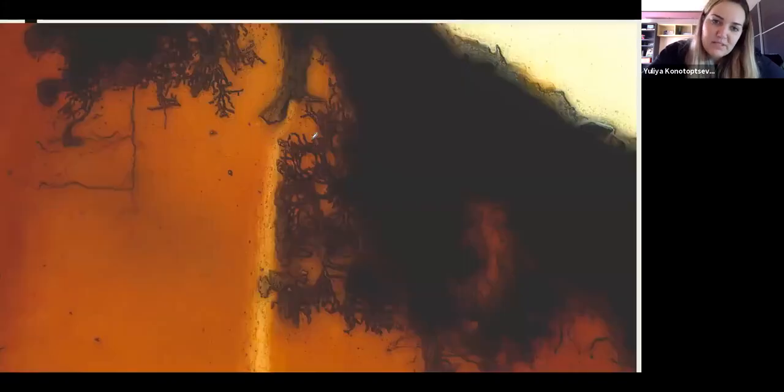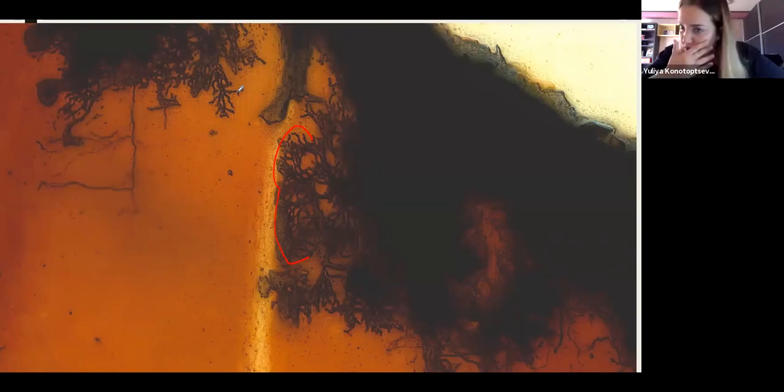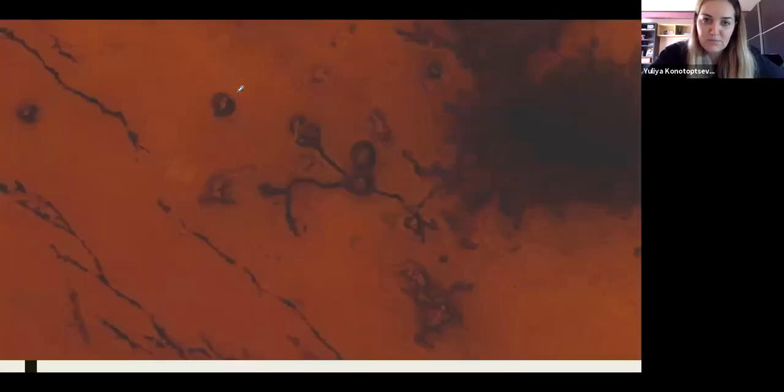Okay, so the same idea. These are the dendrites of the Purkinje cell. Look how spiny they are. Okay, they're very spiny. So don't forget that Purkinje cell is the most inhibitory neuron in our body. And you can see this.